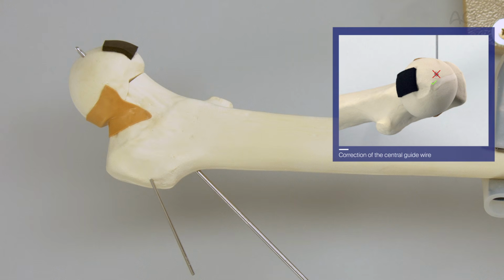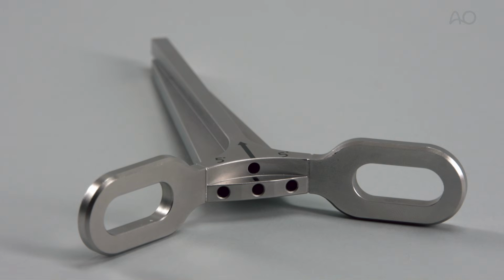more posteriorly. The FNS correction guide provides 3 adjustment possibilities: a correction of the entry point by 5 mm, a correction of the angle of 5 degrees, or a combination of both. This demonstration shows how to perform a correction of both.